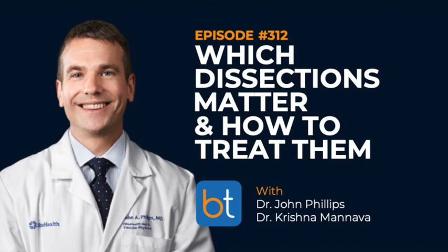No, I mean, it was interesting too that you hear across the country that docs were reporting lack of use because there were acute or subacute closures, and a lot of restenosis or occlusion, where I've seen them restenose, and it's in the tibials. It's between the two tacks. I think the closures are probably related to, in my opinion, failing to see or treat another dissection or some plaque disease, and the thing was going to fail either way.